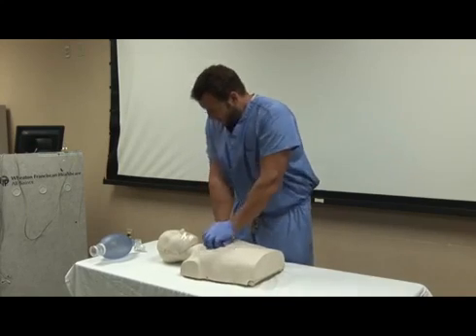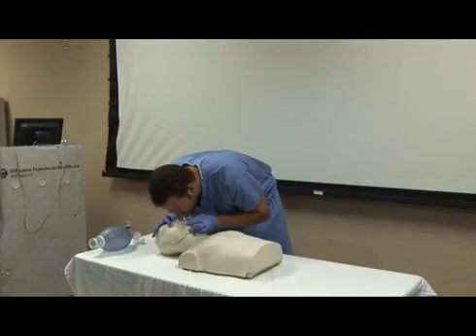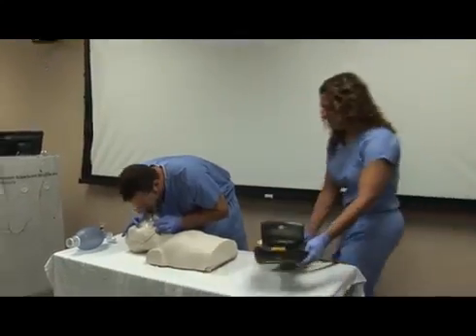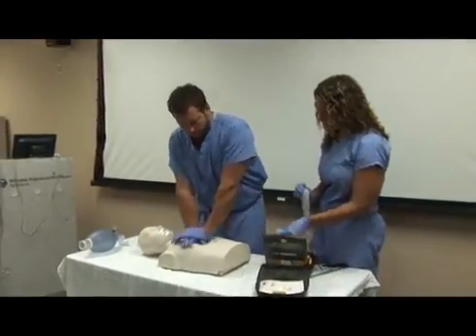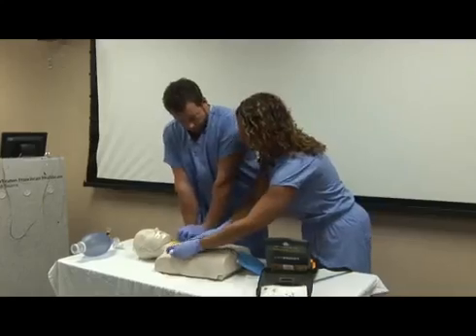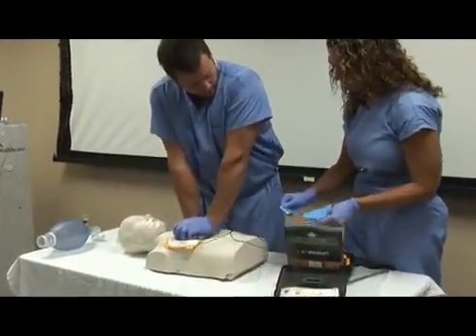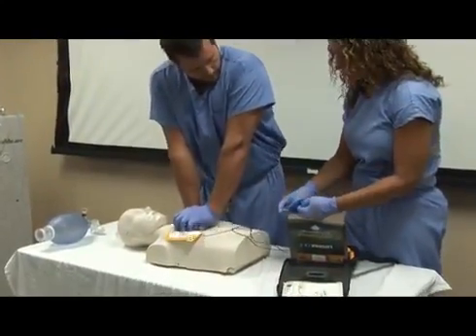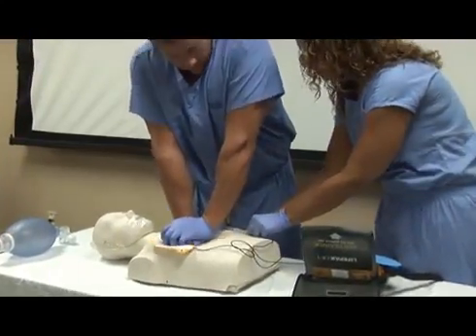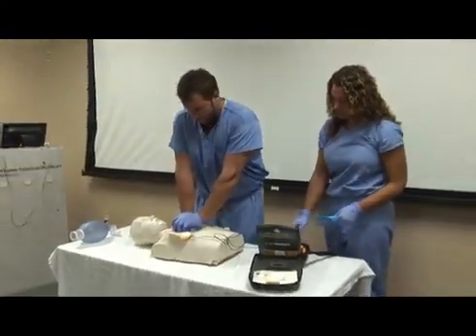Step four is defibrillation. When an AED arrives, follow the AED instructions and apply the pads. Clear the patient to analyze the rhythm, and if advised, ensure all rescuers are free of contact with the patient and deliver the shock. As soon as the shock has been given, resume CPR, beginning with chest compressions.